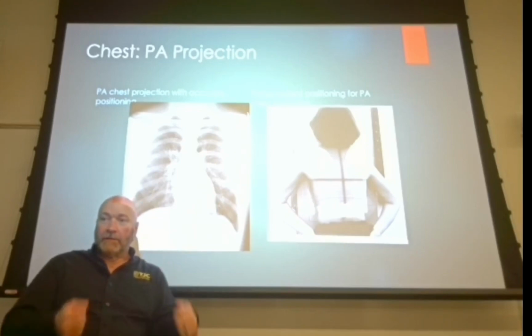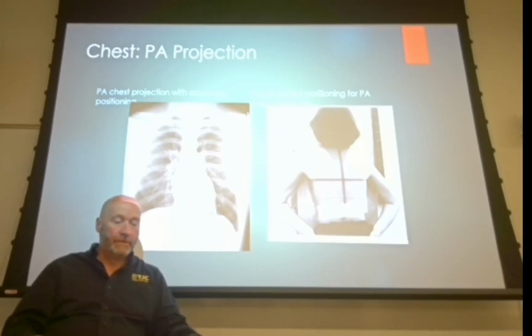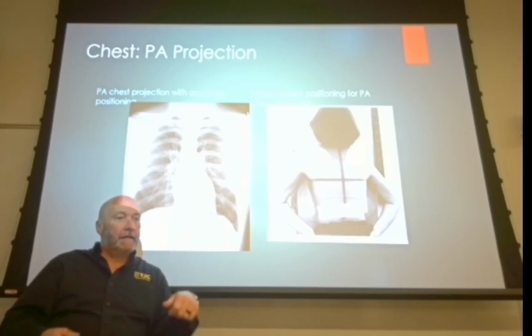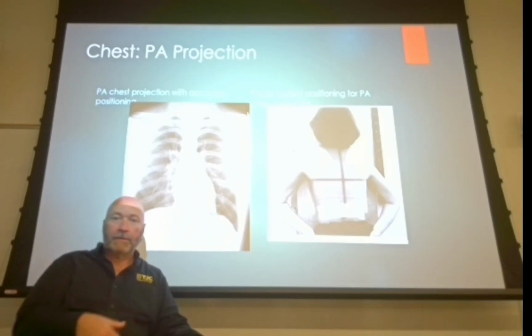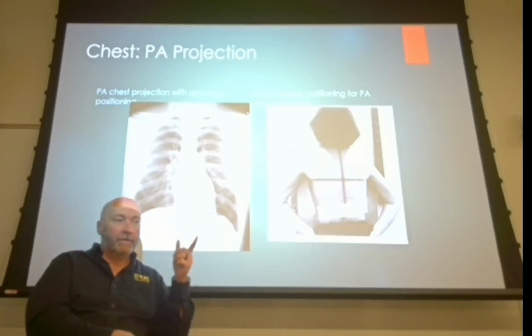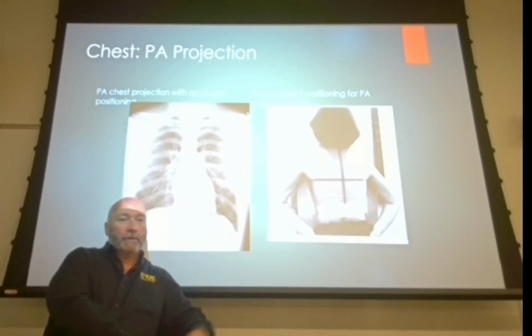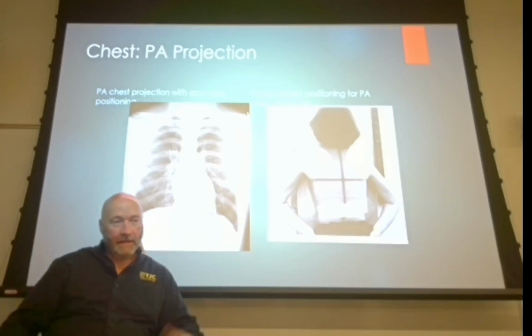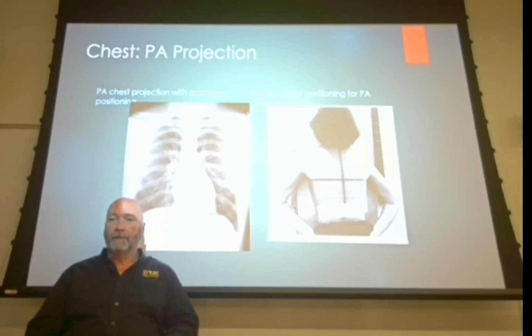So draw sheet is your friend, especially if you're working alone. Draw sheet is your friend. What you want to do is pull the patient up into the bed, and certainly they can push while you get your hand up under their arm and pull them up into the bed. Or if you're working with somebody, just grab the draw sheet, one on either side, and pull them up into the bed. If they're still facing in one direction or another, whichever side they're facing toward, you grab that draw sheet and you pull it, and it's going to shift their hips, and they'll just snap right into place. So now they're straight up, right?